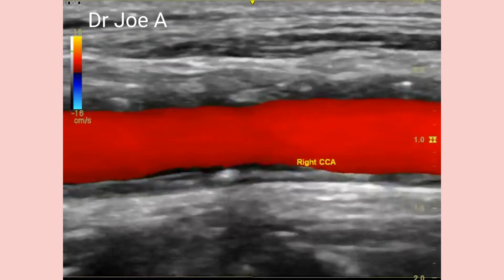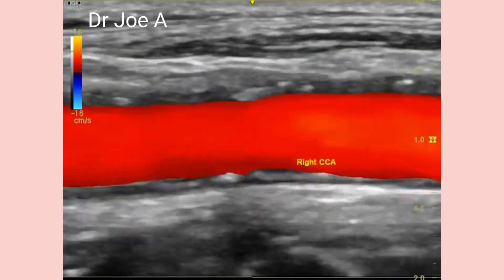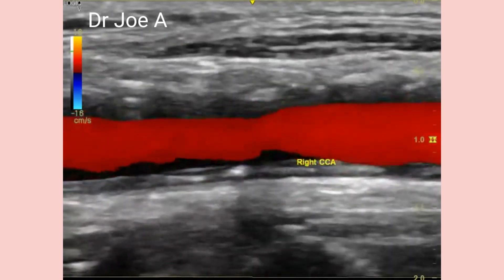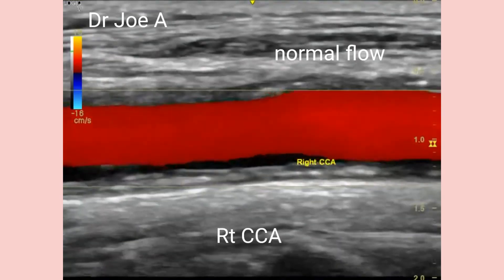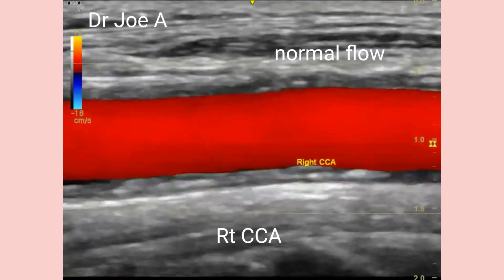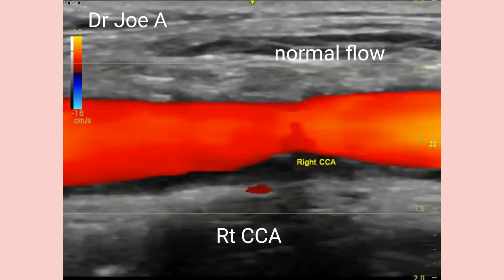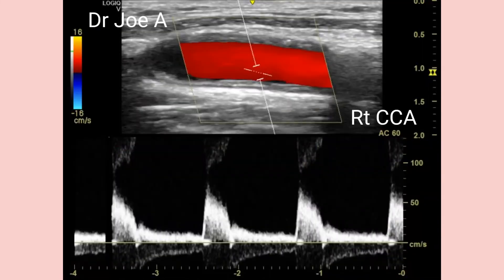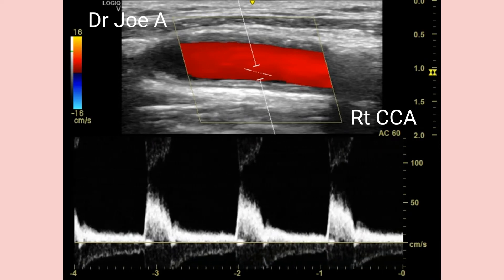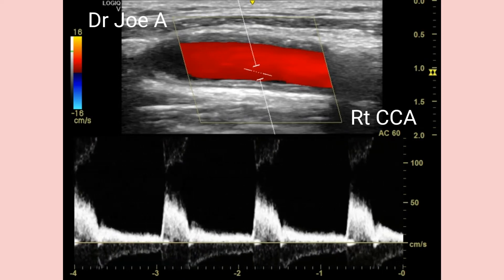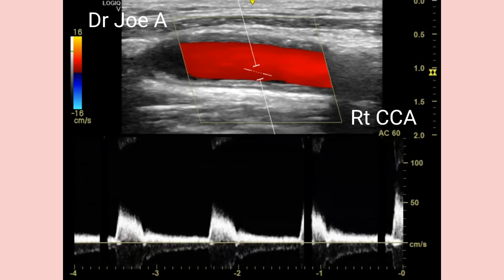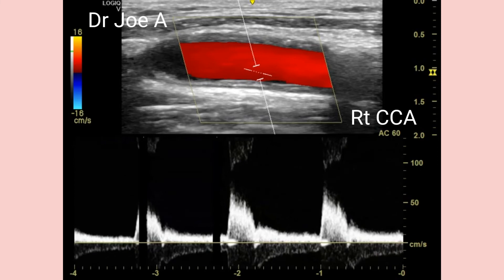Normal flow is seen in the right common carotid artery on color Doppler imaging. Spectral Doppler is also normal.